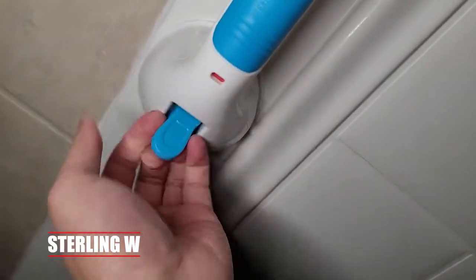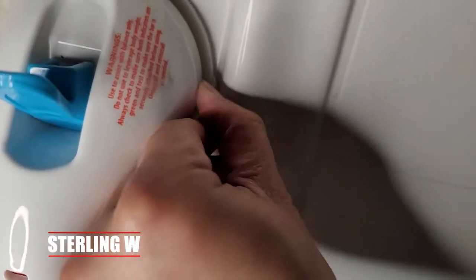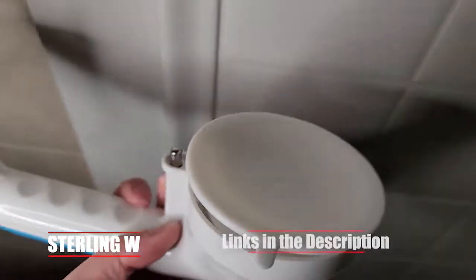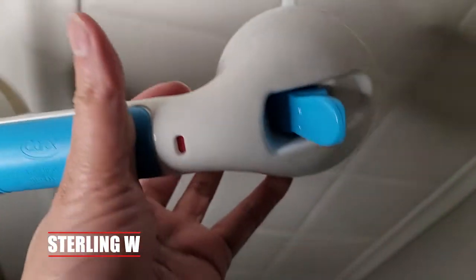All you do is put this against the wall and push those levers down. Now to take it off, you just unlatch the levers, and I usually put my nail underneath that suction cup to release it. I could see this as a good grip to grab other stuff too, so this is pretty cool.